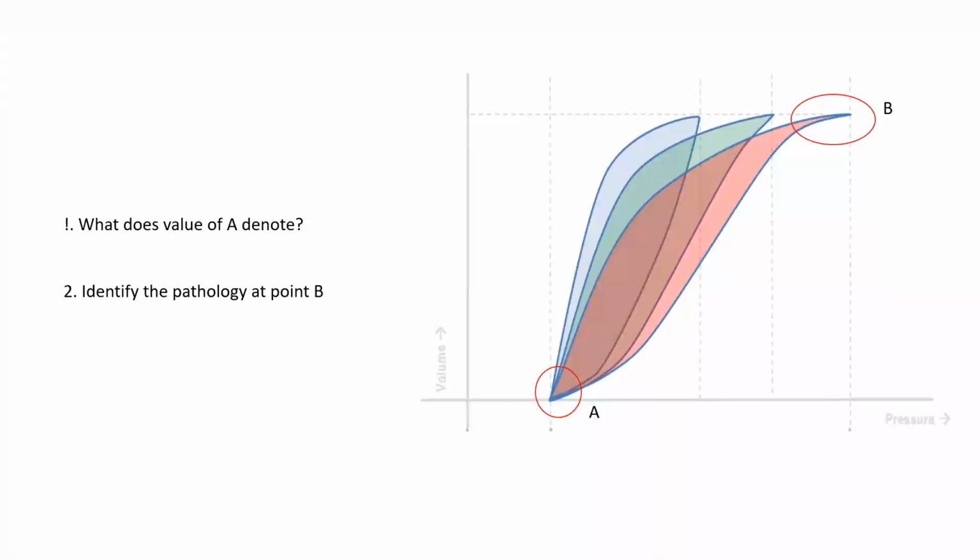The volume will drop. Because the pressure will not change, the set pressure would remain the same, but you will see that the volume curve, or the PV loop, will move towards lower and to the right. So the volume will drop for the same pressure.